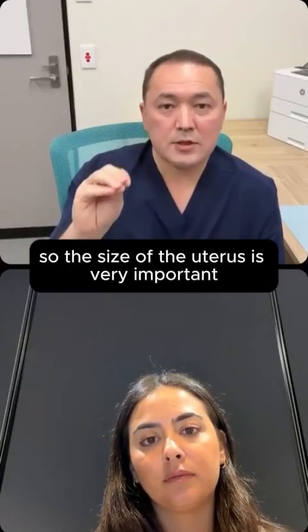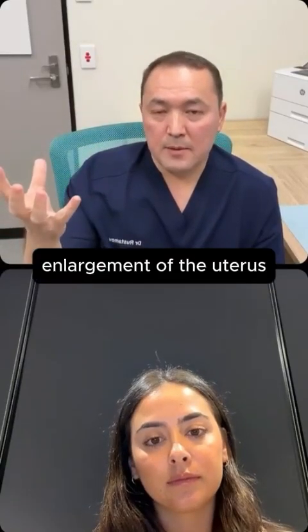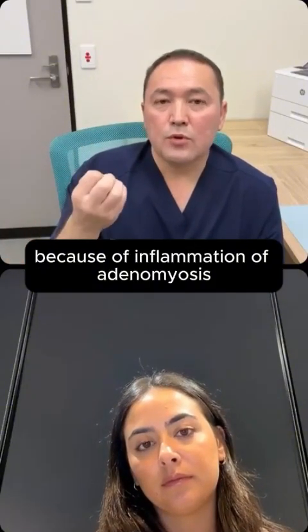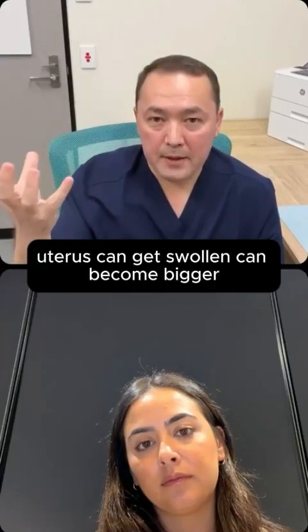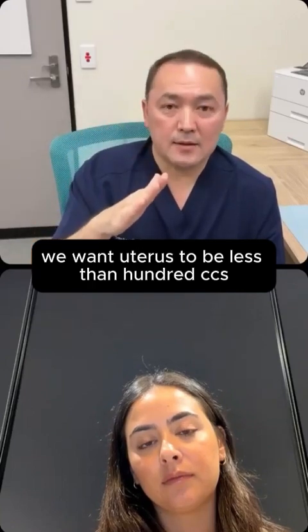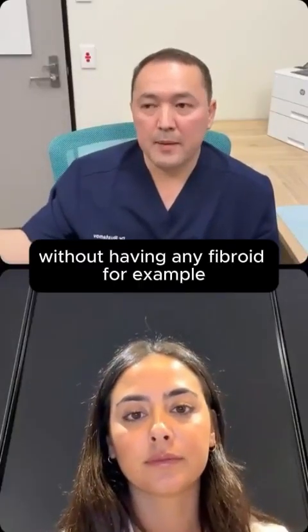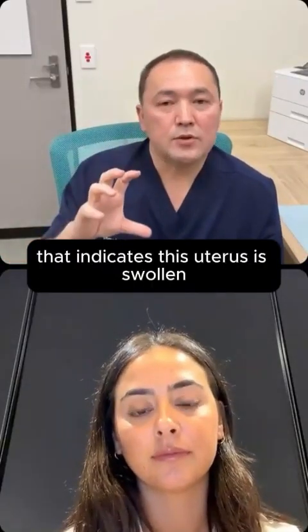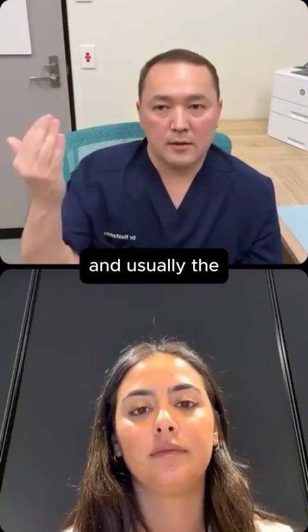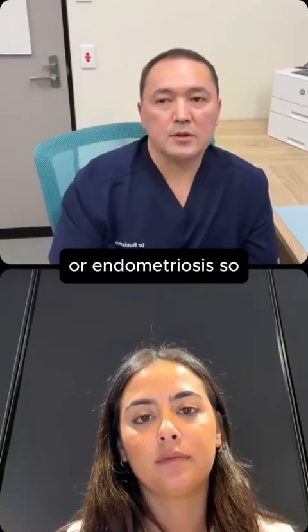Second, they describe the overall structure of the uterus. The size of the uterus is very important. For example, in adenomyosis, enlargement of the uterus may be the only sign of adenomyosis. Because of the inflammation of adenomyosis, the uterus can get swollen and become bigger. Generally, we want the uterus to be less than 100 cc's. If you have a bigger uterus without any other explanation, without any fibroid, for example, that indicates the uterus is swollen, very likely due to inflammation. And usually the main cause of inflammation is adenomyosis or endometriosis.